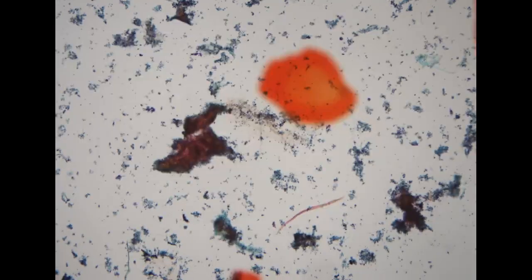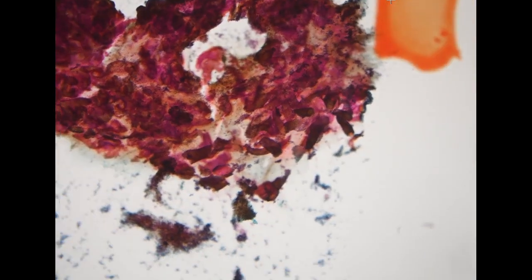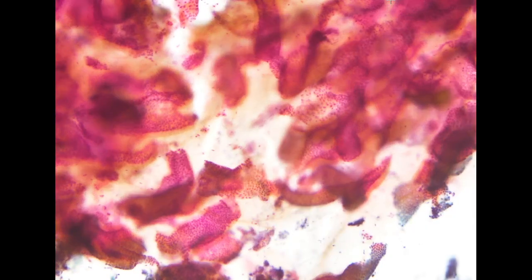So the final case is pancreatic fine needle aspiration from a 61-year-old male. So this is a very cellular specimen, and here you can see there is a large area of like a three-dimensional glandular material.